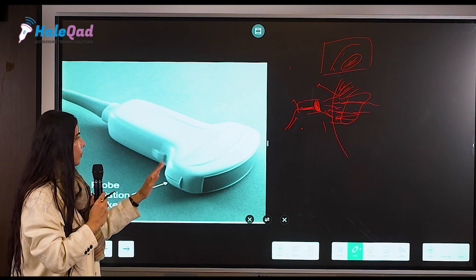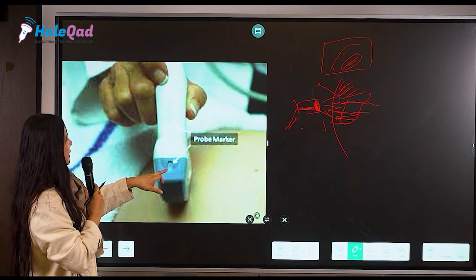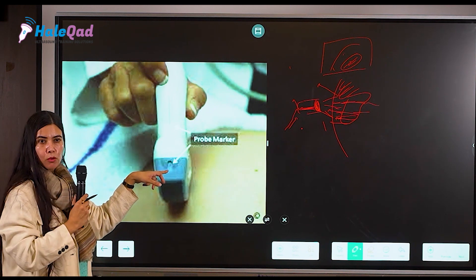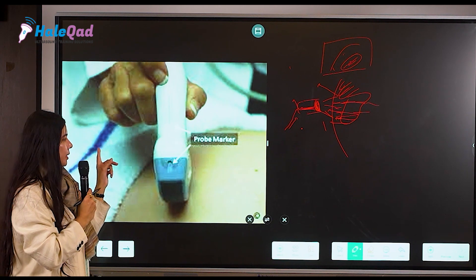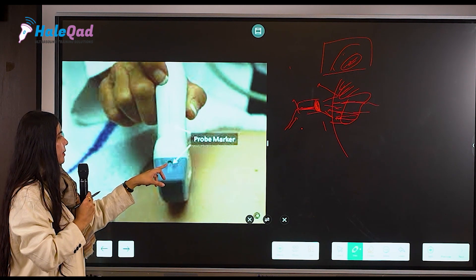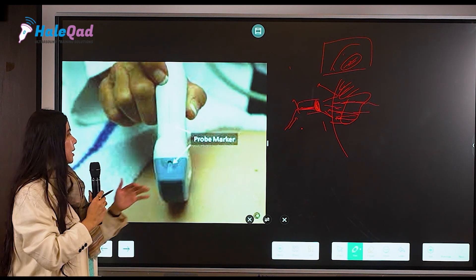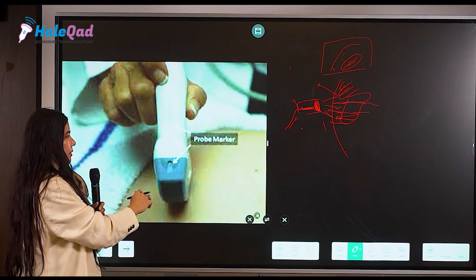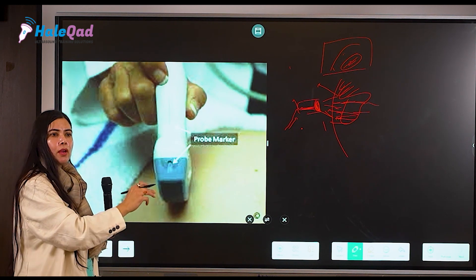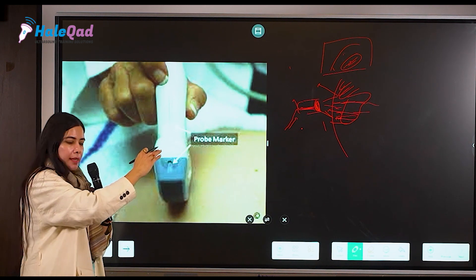This probe is from a GE machine, and here the marker is like a depression — on the previous slide it was like an elevation. This is why it is important: wherever this marker is, it has to be on the right side of the patient.